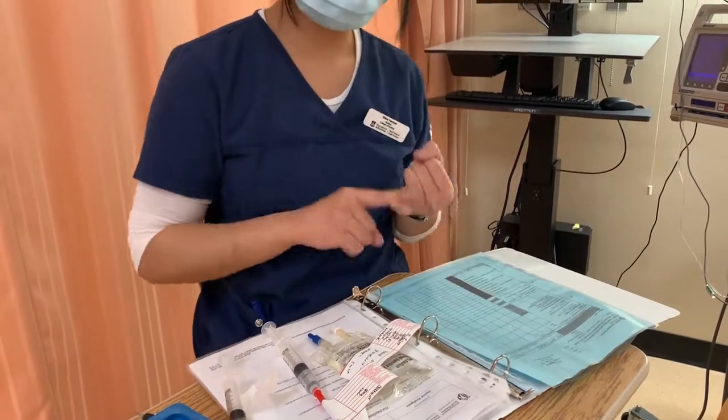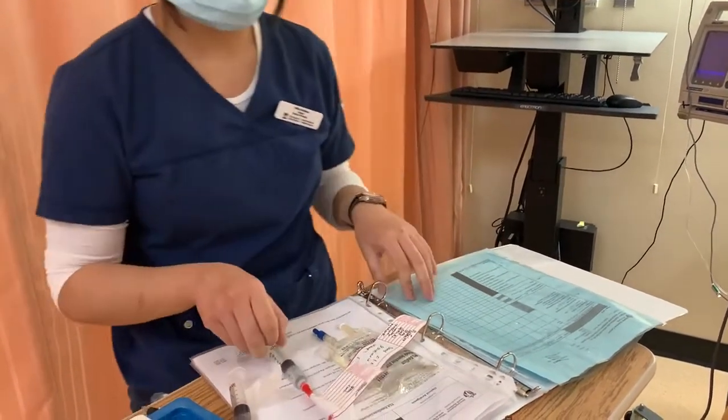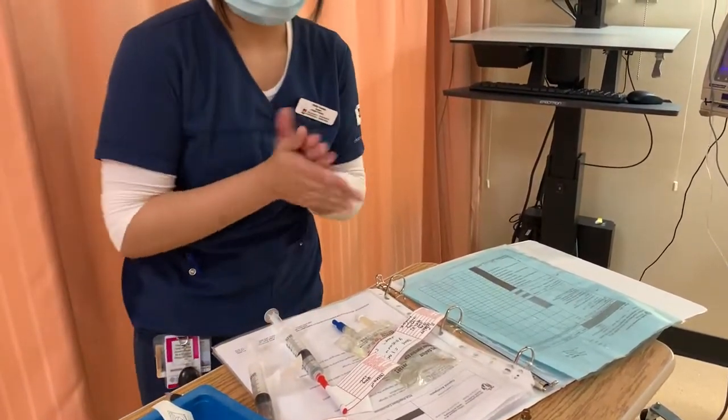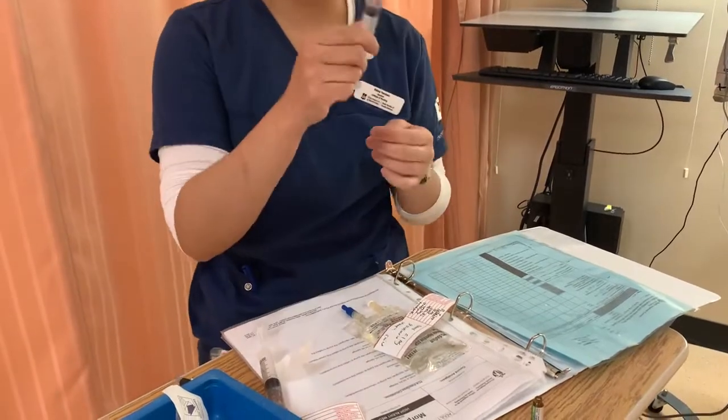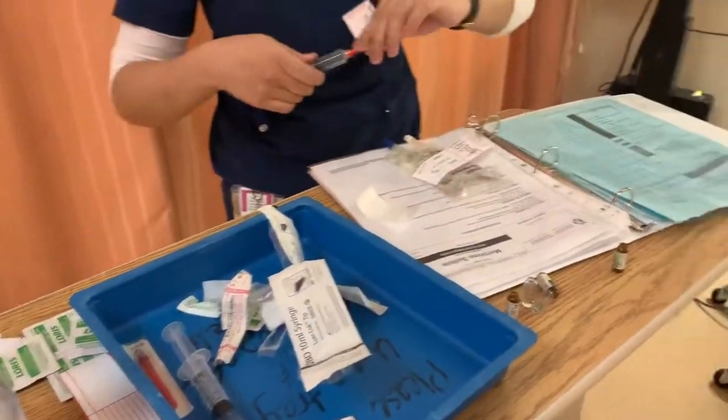So I got my right patient, right medication, right dose, right route, and the right time as well. So now my second is gonna check that. They checked it, everything's okay, and now I can inject the medication. I'm making sure that it's the morphine. So the normal saline goes to the waste and the sharps container as well.